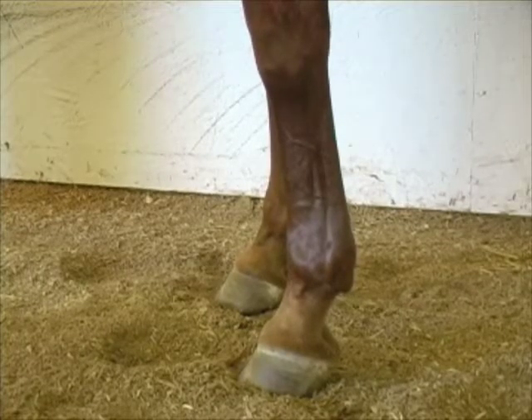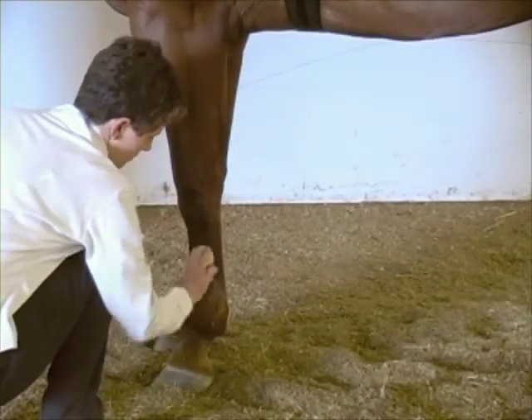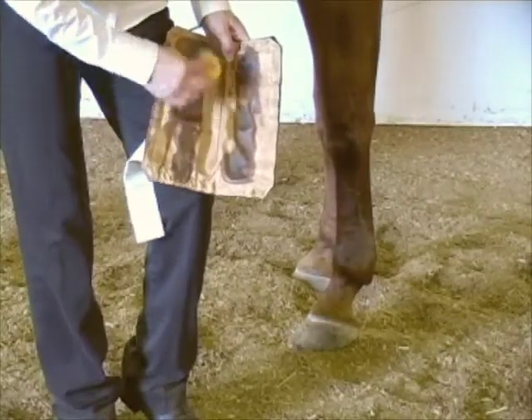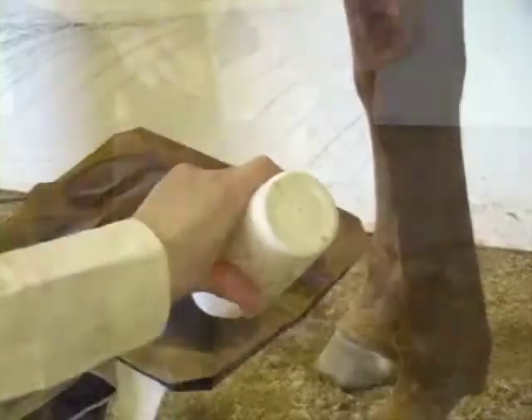The leg pad can be placed on the lower leg below the knee or hock, or on the upper forearm or gaskin. Thoroughly wet the skin and the area to be treated. Wet the nylon liner only where the electrodes are located. Place gel over each electrode.